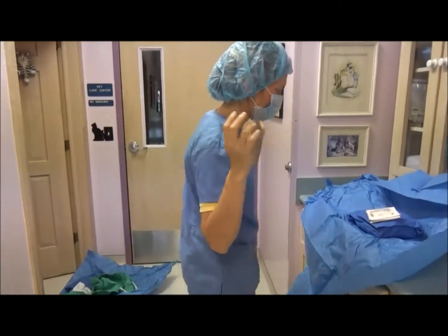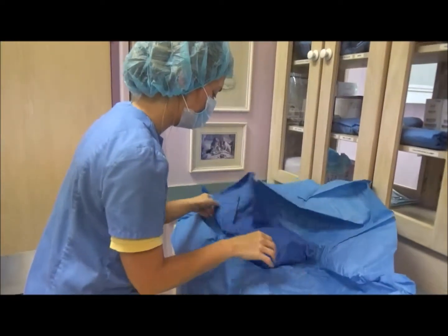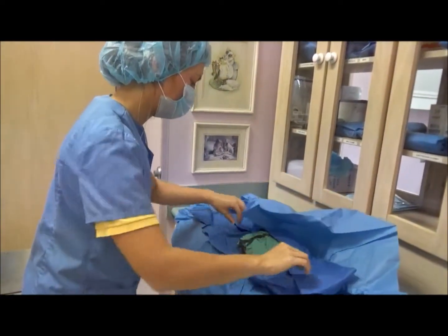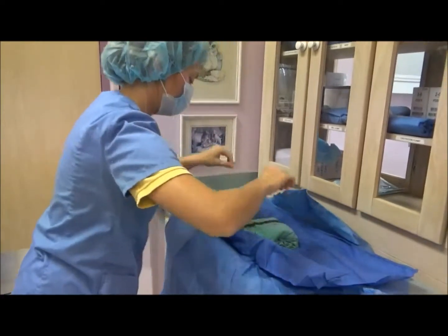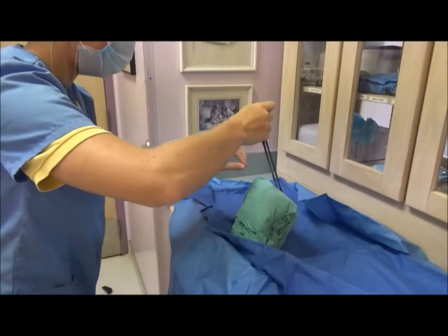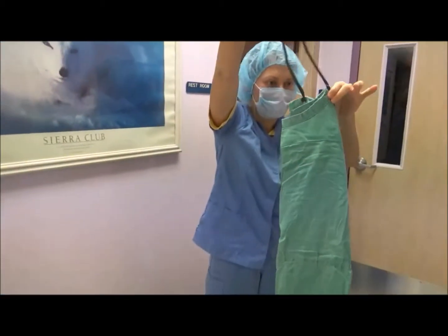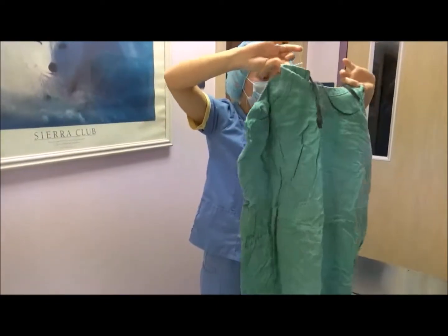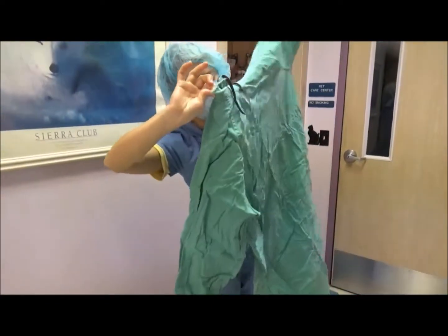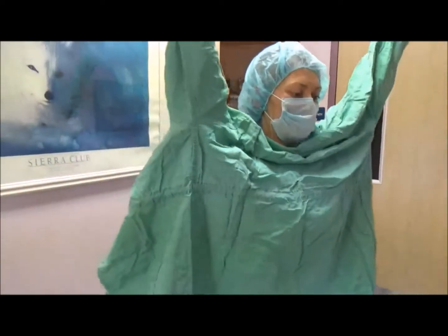Okay, that feels pretty good. So now I'm good to open the gown here. Okay, so once I locate the collar of the gown, then I look for the armholes, and then I'll insert my arms into the holes, but I don't want to put my hands all the way through the gown.